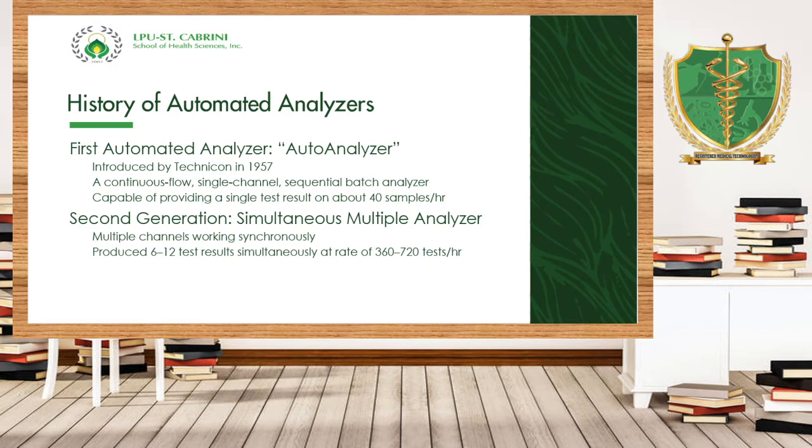It made our processes in the clinical laboratory section fast because we don't have to spend too much time in making these tests possible, because we have these machines that will help us to do our test, not to do our analysis. However, like what I keep on telling, I still want you to know the basic or the manual one, and I don't want you to rely mainly on the result given by your equipment or machine because you have to check it also. You have to verify if that's really the result.